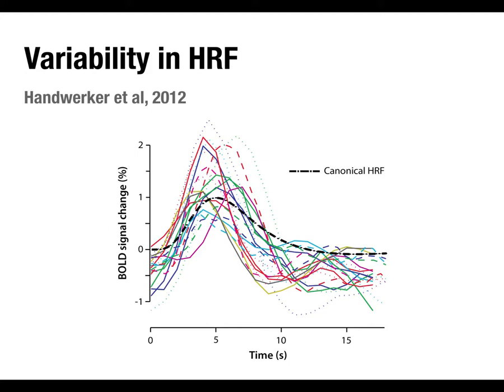What would be meant by a negative bold signal change before there's the stimulus? Because the stimulus is at the 0 time, right? Yep. So a couple of them are almost at -1, when there's a stimulus. Why would that not be set to 0?